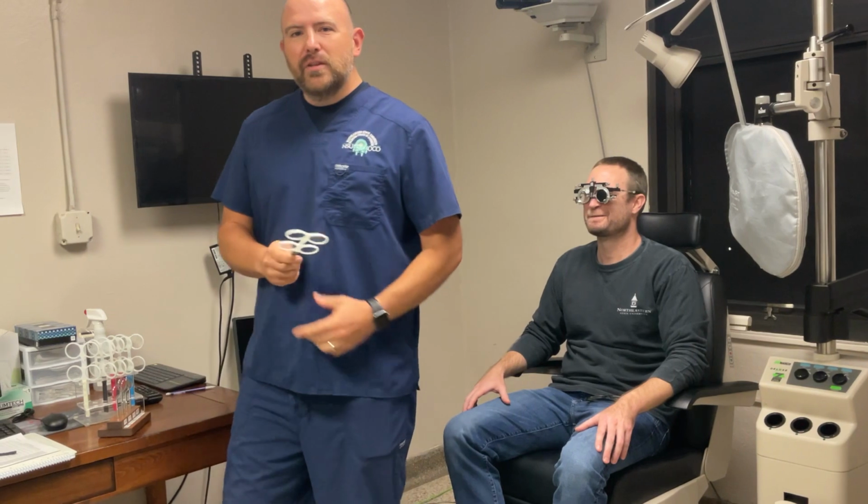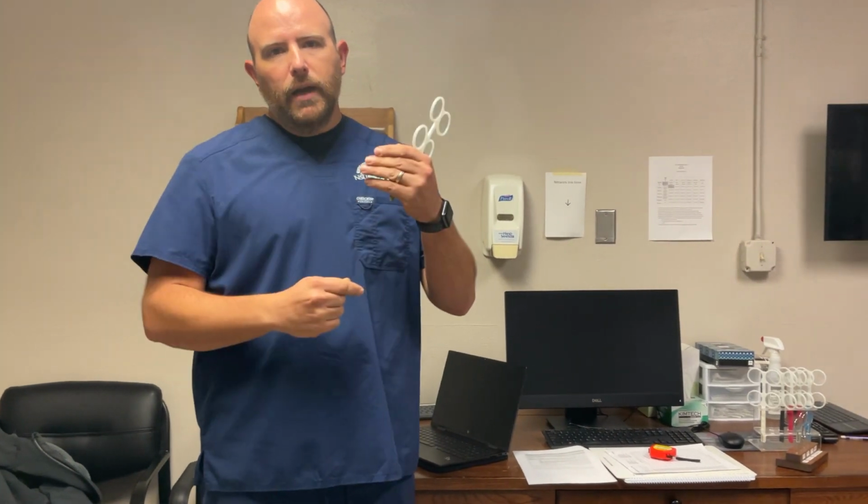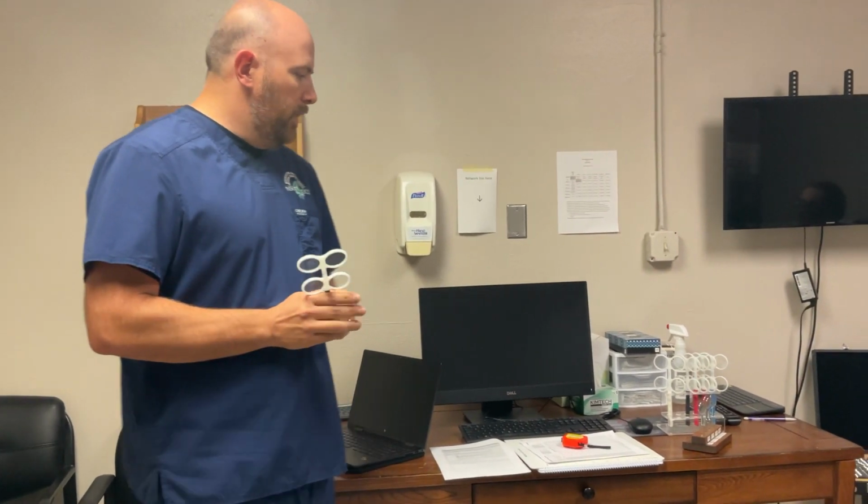And so the final step for the proficiency is to look and see what the patient's VAs are, and in that way we can determine Kestenbaum's rule, or the approximate add that the patient will need. So let me look at the Snellen acuity real quick. Since the chart's at 4 meters, we can look over here at the Snellen acuity, and the acuity is 20/63. And so at this instance, Kestenbaum's rule, all we have to do is invert the fraction, and so it's 63 divided by 20, which is somewhere around 3 diopters. Now if we were going to double that, we would give the patient 6 diopters for comfort while reading. And I think that's it.